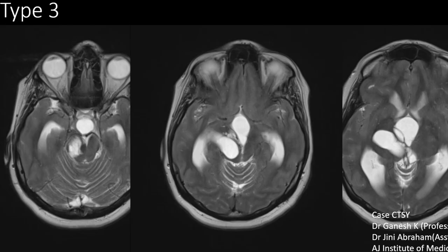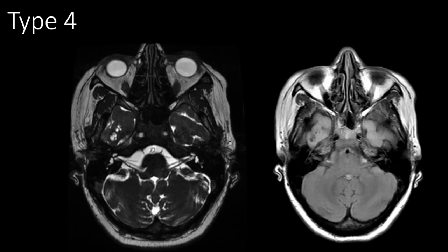Type 3 perivascular spaces are located in and around the brainstem. There is a cystic lesion with septations involving the brainstem, extending into the right thalamus and causing compression of the aqueduct and posterior third ventricle, resulting in hydrocephalus. These are probably the only perivascular spaces which will require neurosurgical intervention to relieve the hydrocephalus.